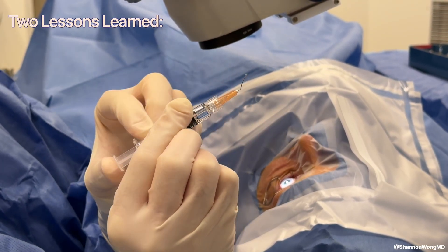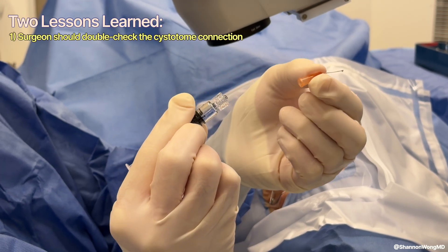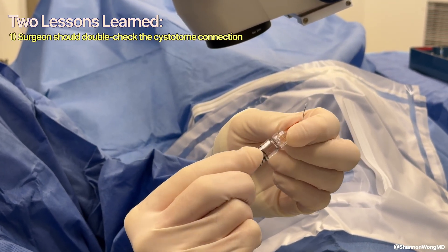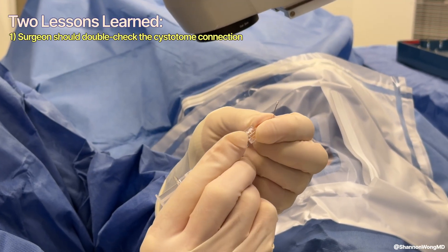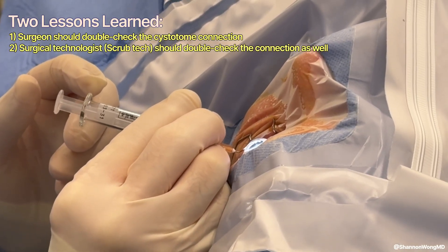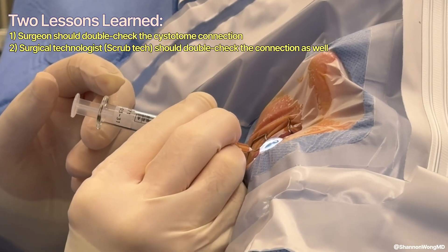So there are two lessons learned. Henceforth, I will double check the tightness of the cystotome hub to the viscoelastic syringe before I place the cystotome into the eye. And number two, I will better educate our scrub technicians to double check this step as well.